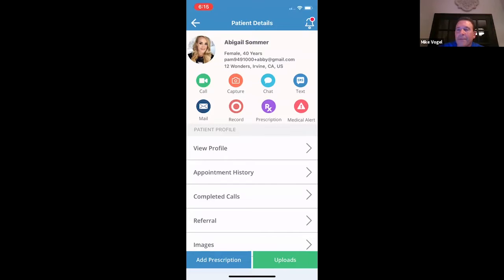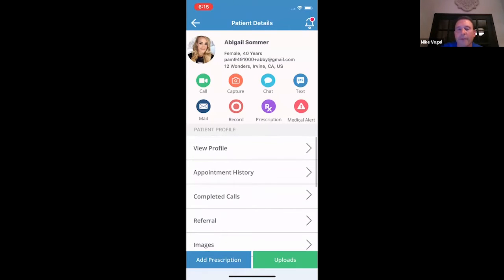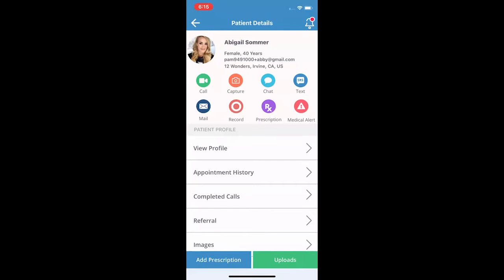Michelle, did I cover it all, or is there anything else that I missed about the provider app, other than the fact that it's real time? No, you pretty much got it. You're a great little user. I love it. All right. Well, I will kick it back over to Daniel.